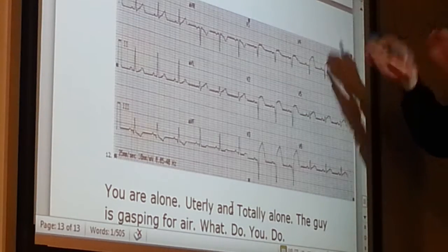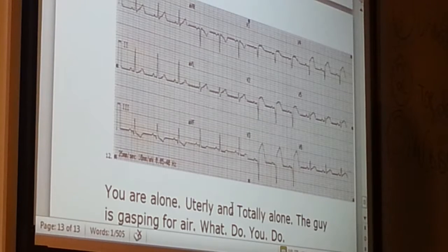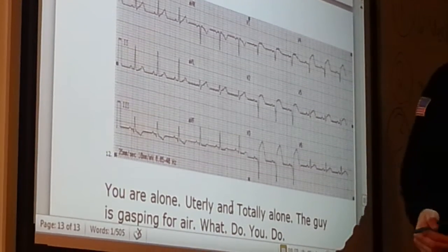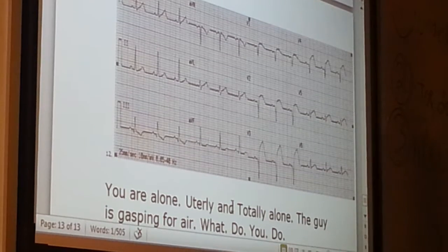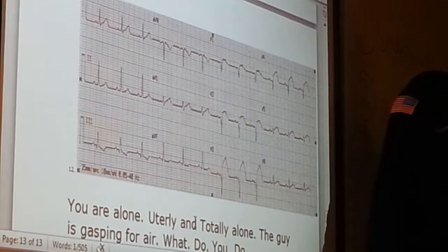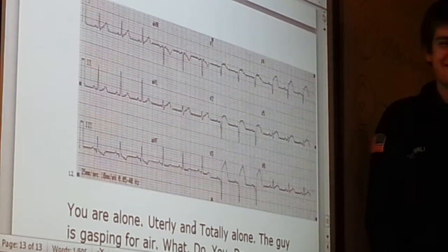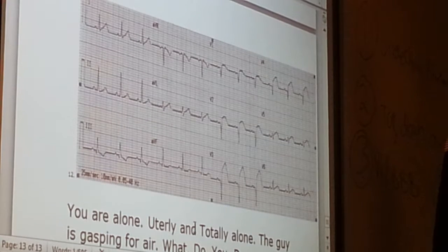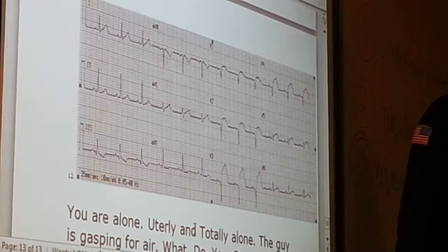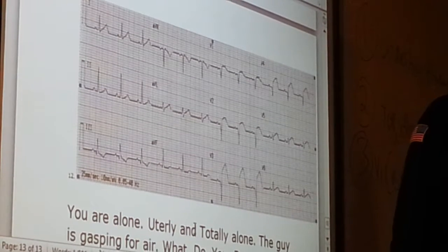It's inverted just that way, right? And when it's inverted, it's backwards inverted, it's like a double negative. So we call that elevation. When you have ST segment depression, that's a double negative, it's elevation. So when you come down like this, it's going to be ST segment elevation. There we go. Double inversion. Does everyone see that that is very clear ST segment elevation? Okay, yes.